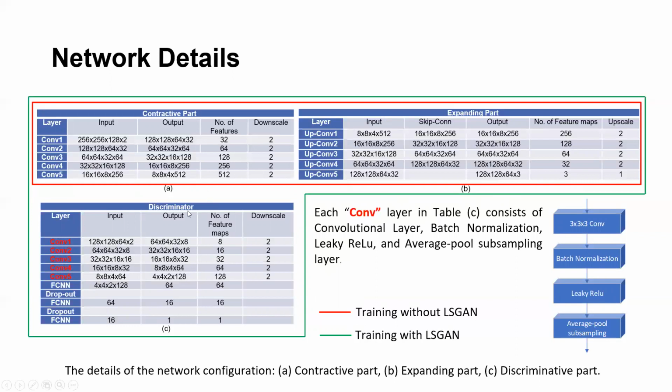The discriminator in this case is basically a classification network that consists of sets of 3-dimensional convolutional neural network layers, but in detail they are listed on the right of the figure. You can see that we are using 3x3x3 convolutions, batch normalization, Leaky ReLU, and average pooling.